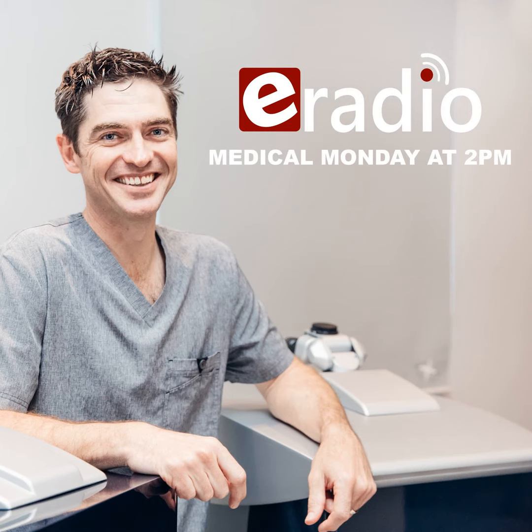And secondly, yes, the machines every now and again do have upgrades, so software upgrades. When there's a new type of laser profile that's introduced onto the laser, then those are generally software upgrades, and the technicians come in. And we've got very, very capable and excellent support in South Africa. Our technicians that service our lasers are internationally trained. They look after us. The lasers are exceptionally intricate and need to be serviced at least twice a year.